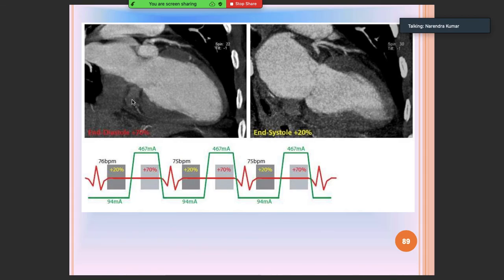Your cell phones are becoming smarter. Similarly, are these devices, these gadgets. Better tools are coming, and in fact, nowadays, in rapid chest pain access clinics, its role has become immense.